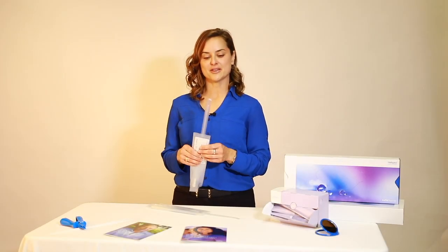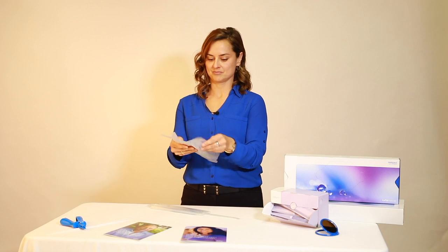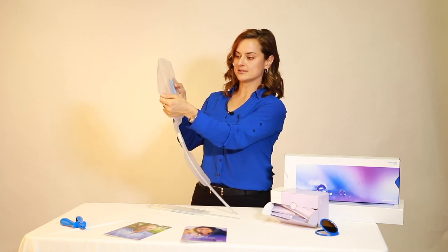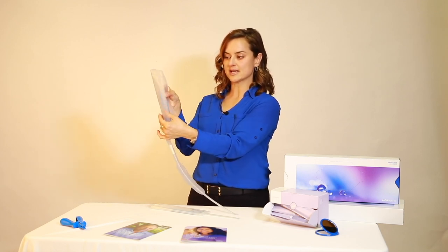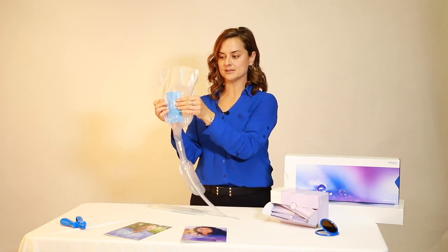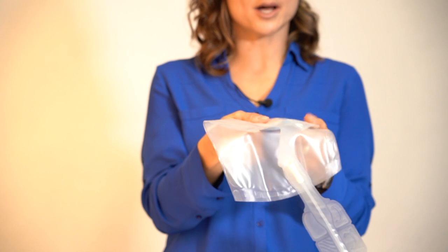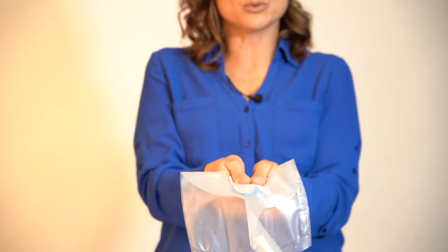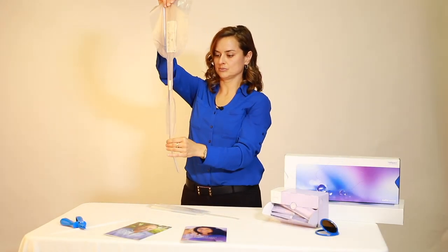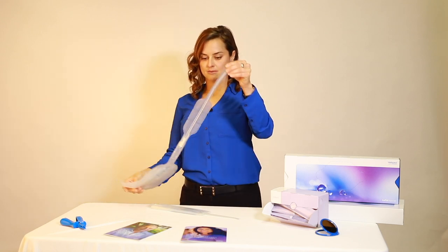The Lofric HydroKit catheter is our all-in-one kit that has instant activation. I'll demonstrate two different ways that the sachet can be released. This is a salt solution sachet. It's important to have the salt water in the bottom half of the packet, then fold the packet over, trapping the salt water in the bottom half, and give a quick squeeze using your two thumbs. The catheter is fully coated and ready for use.